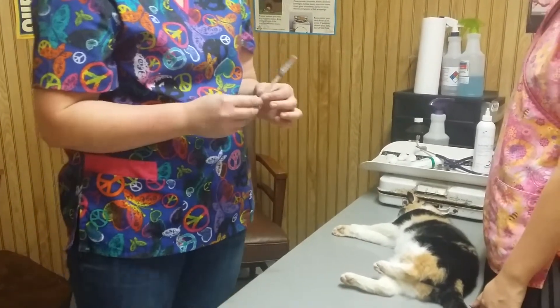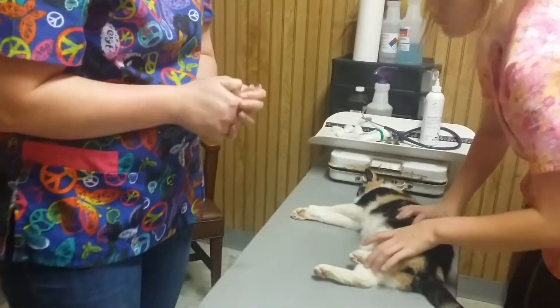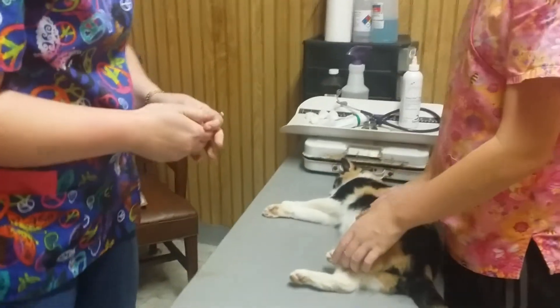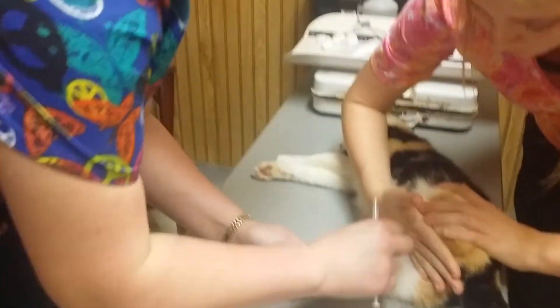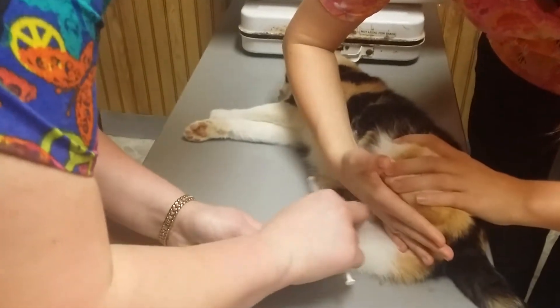Make sure that it's working correctly, and I'm going to apply the cotton ball with alcohol.